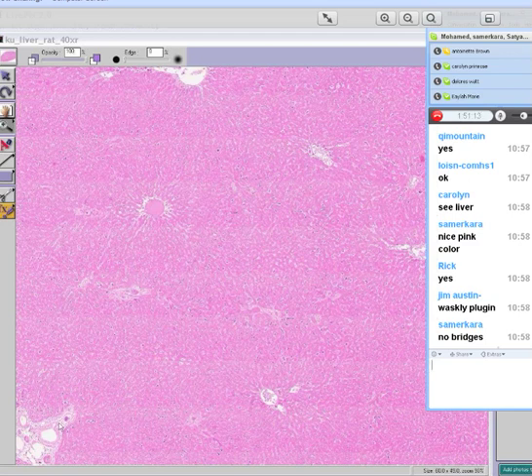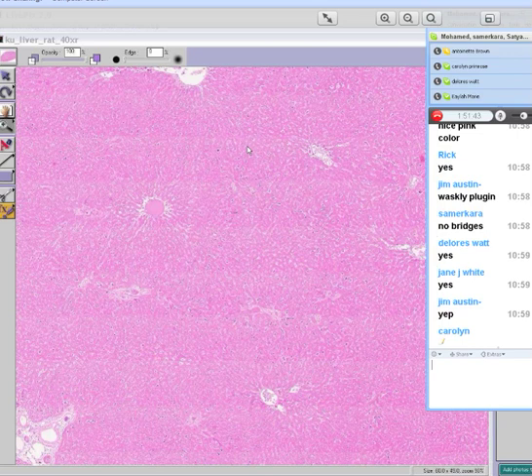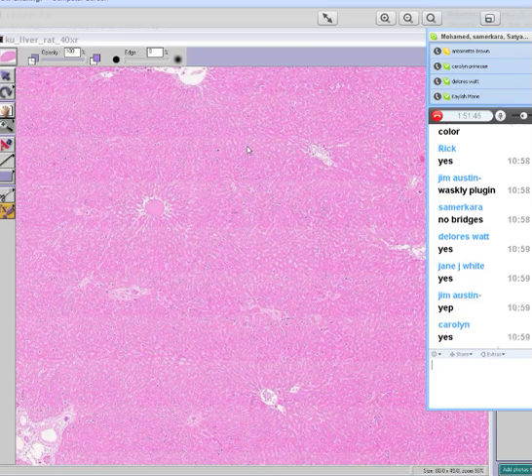On the other hand, what you see here and especially here does have a bile duct and connective tissue and maybe a little bit of artery. So you know this is the central vein and this is the portal vein. And here's another portal vein. And it looks like this could possibly be a central vein. It is, because there's no connective tissue. And here's another portal vein. Okay, are you seeing all that, folks? Because what I'm about to tell you is extremely important.